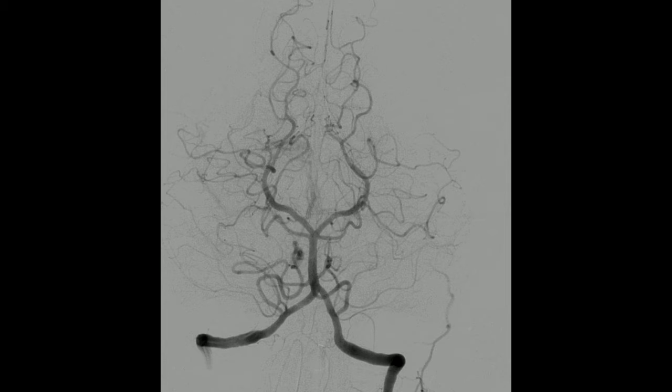For some applications, cerebral angiography may yield better images than less invasive methods such as computed tomography angiography and magnetic resonance angiography. In addition, cerebral angiography allows certain treatments to be performed immediately, based on its findings. In recent decades, cerebral angiography has so assumed a therapeutic connotation thanks to the elaboration of endovascular therapeutic techniques.